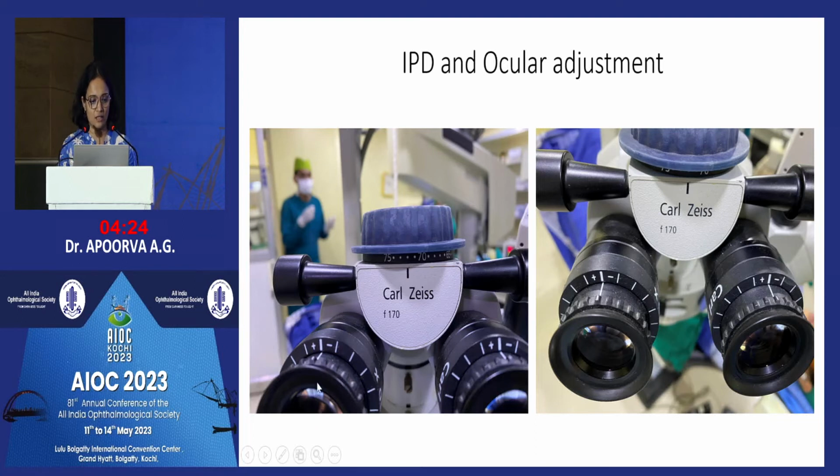So this interpupillary distance is mainly when the two images of the eyepieces are finally merged into one. This can take many months and sometimes years to realize what our IPD is. This is the diopter ring where the dioptric lenses are housed. This can go up to +5 and -8. So people with refractive error wearing their prescription glasses have to keep this at 0. This mark on the eyepiece has to be set to 0.